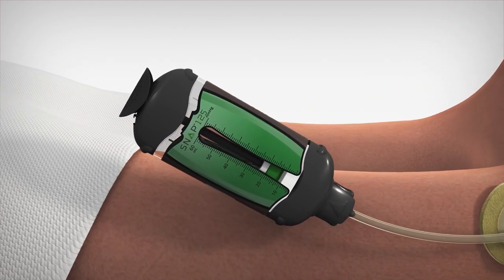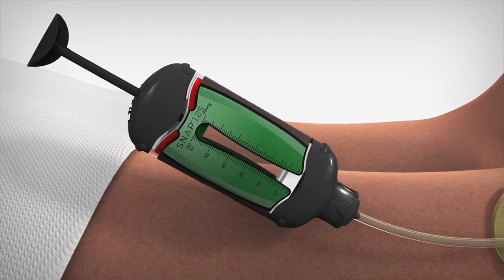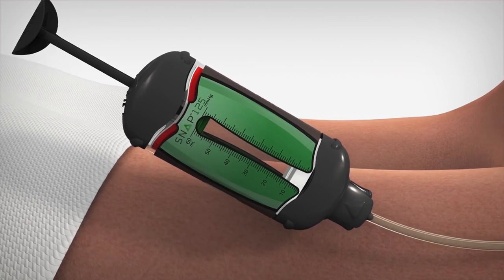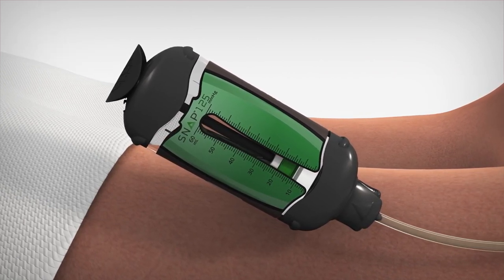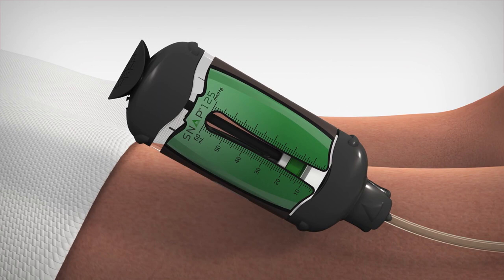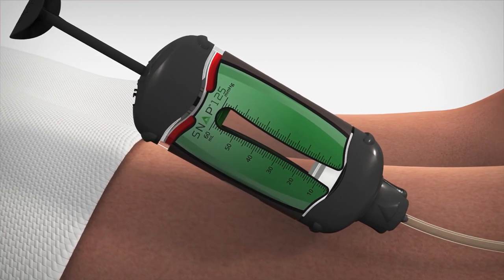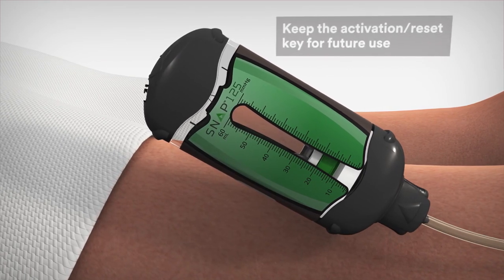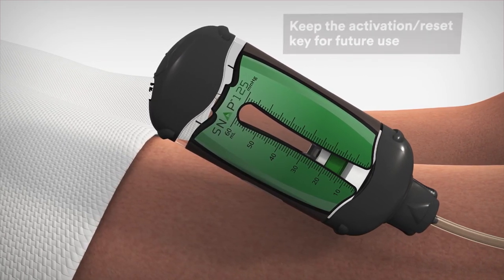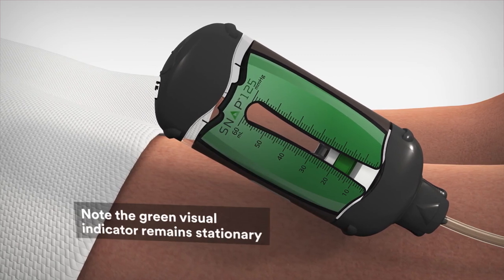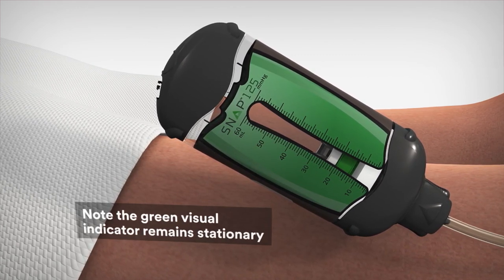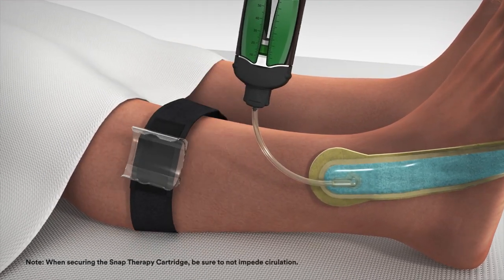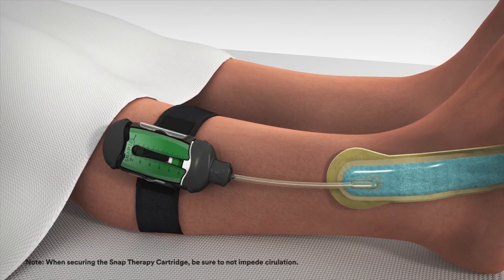To activate the cartridge, press down on the activation reset key and pull it out. Reinsert and repeat as needed until an airtight seal is obtained and the red pressure discharge indicator is not visible in the pressure discharge window. With the bridge dressing, the cartridge may need to be reset and reactivated several times to remove excess air from the dressing. The green visual indicator should remain stationary to verify that there are no air leaks and excess air is removed from the system. The SNAP therapy cartridge can be secured to the leg with the SNAP therapy strap.